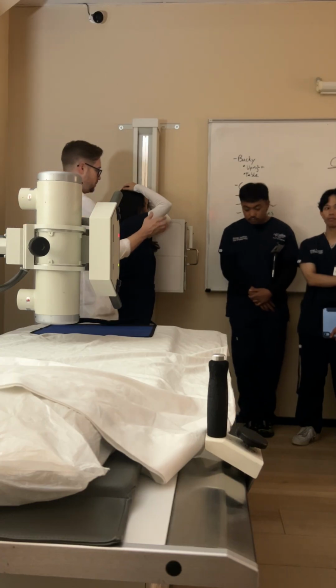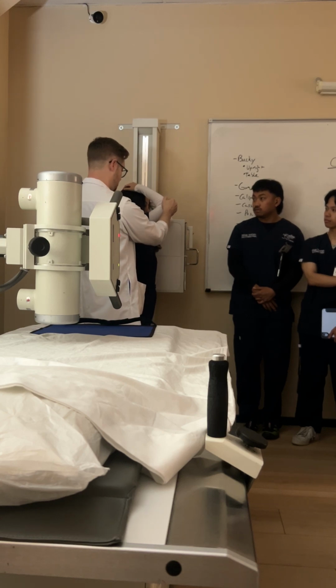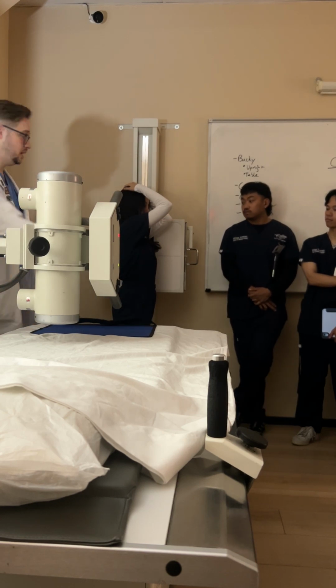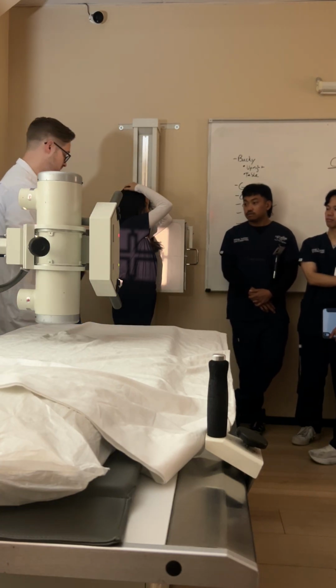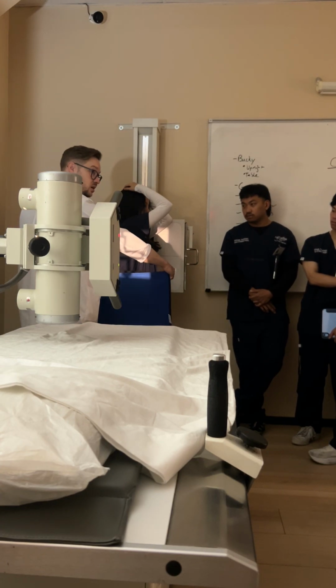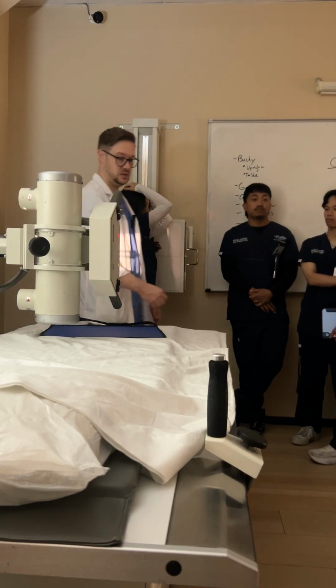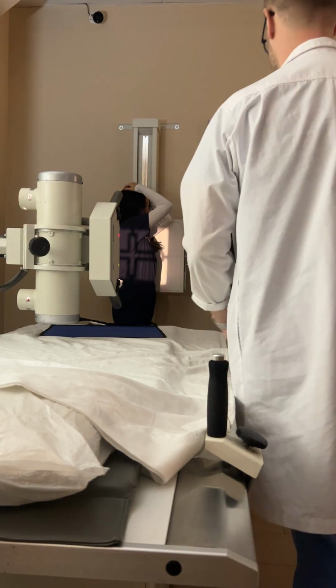Okay, second thing I'm going to do: I put my hand on one of the elbows and one hand on their back to make sure that their back is completely perpendicular to the bucky. The shield is still on, but the distinction is that I'm going to move it from here to here. The marker doesn't need to change. It's still good to leave it where it was for the PA, as long as we used it left.